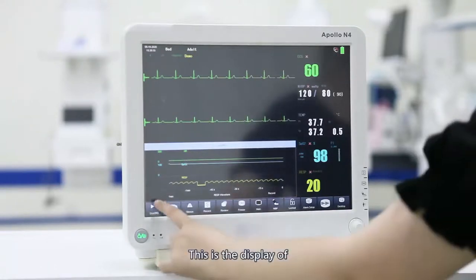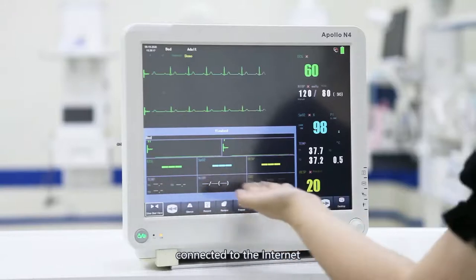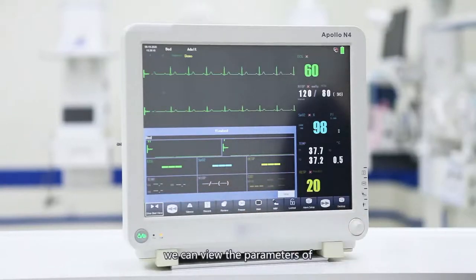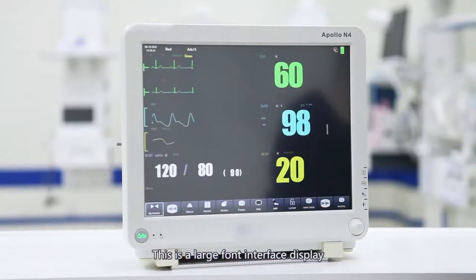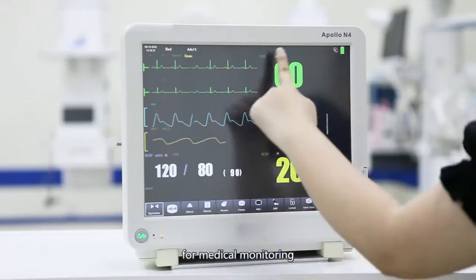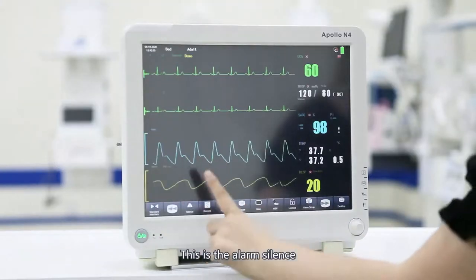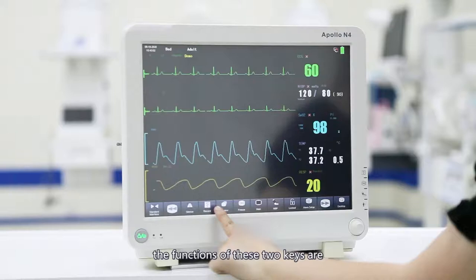This is the other bed observation interface display. If there are multiple devices in the department connected to the internet, we can view the parameters of bed monitoring through the network. This is a large font interface display where the main parameters are enlarged, which is convenient for medical monitoring. This is the alarm silence and this is the record key; the functions of those two keys are the same as the shortcut keys.